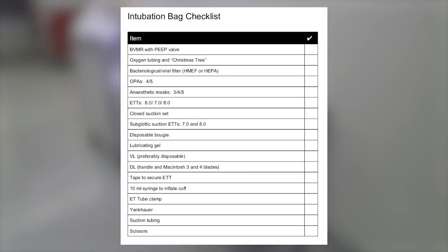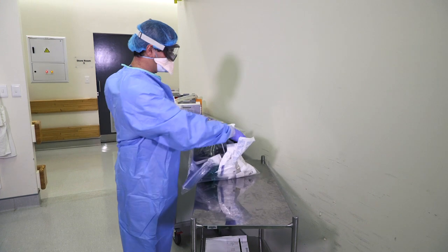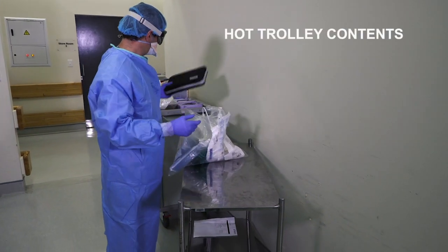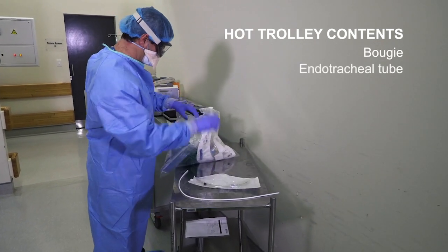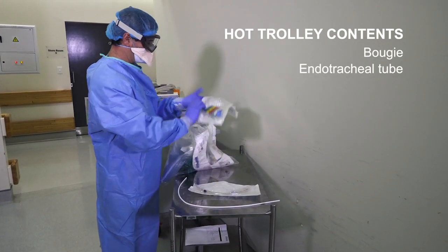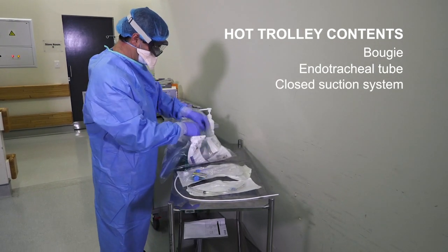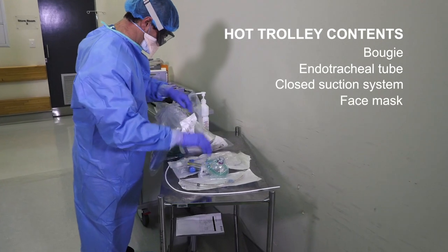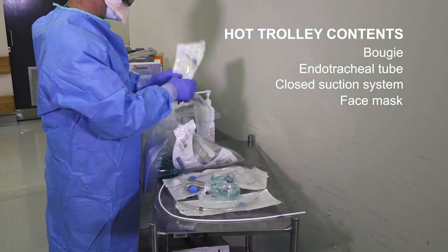All the equipment required for routine airway management can be found in the pre-packed airway and rescue bags. Ross, please pack out the essential airway devices on the hot trolley. The direct laryngoscope will stay outside on the not-hot trolley. A bougie will go on the hot trolley. A size 8 tube on the hot trolley. Closed suction on the hot trolley. Mask on the hot trolley. Spare tube stays outside on the not-hot trolley.